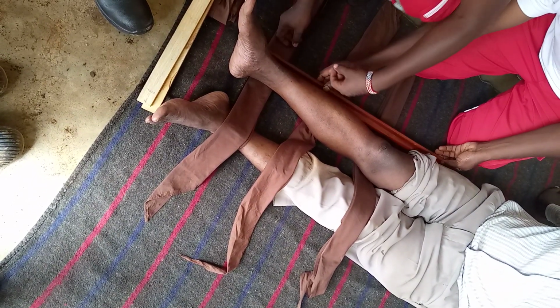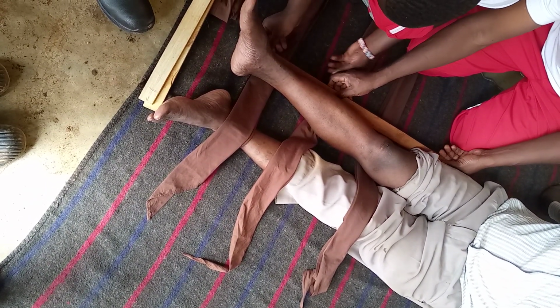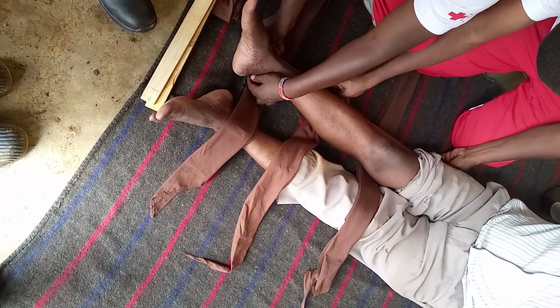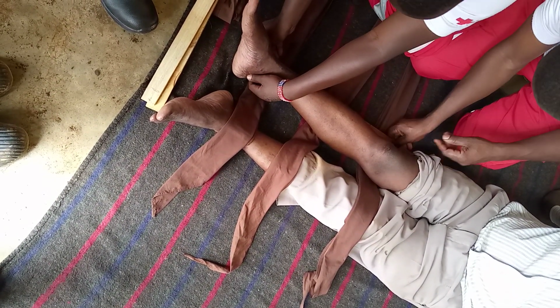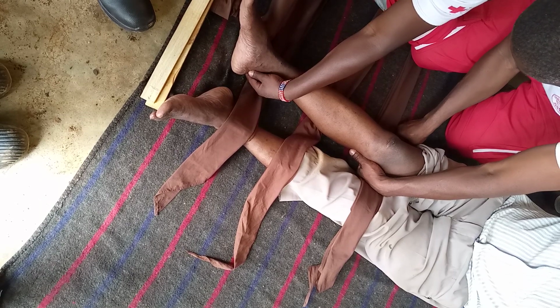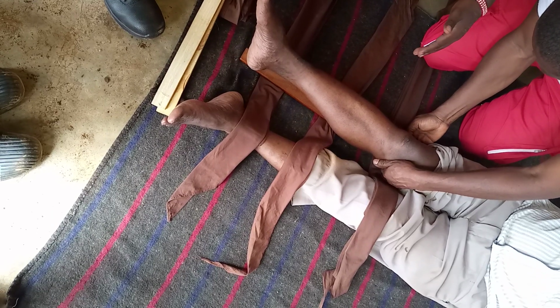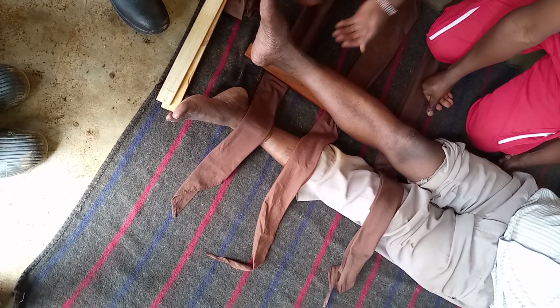Then we shall fix one of the splints down here very slowly. Have you seen? Have you lifted like? So don't lift somebody's what? Leg. But you're in gloves, eh? You should be in gloves.